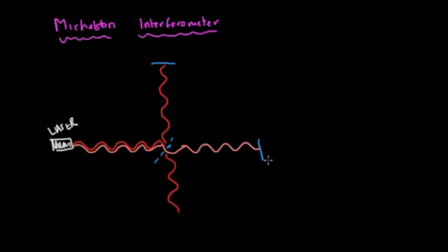And then the light that came over to the right here also strikes the mirror, passes back, but this time hits the half mirror and is reflected downwards. So we have these two beams that traveled the respective legs of the apparatus and then are recombined, and then finally they strike a detector, and I'm just going to draw an eyeball down here. So this is how we're seeing what happens.